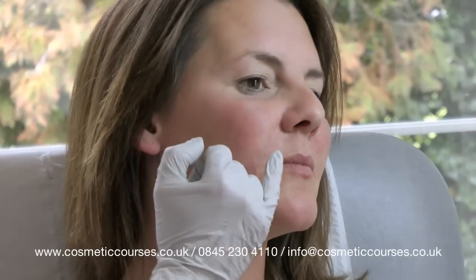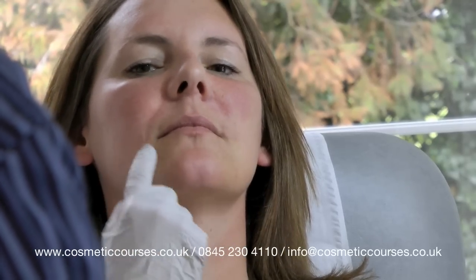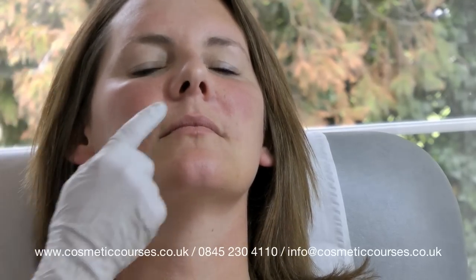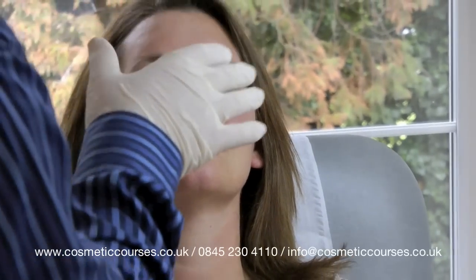Another day we could do this area here. Look at the canvas — we can say it's not quite finished; we could do this area and perhaps that on another occasion. You've got quite high cheeks, as you know, so you will still have a shadow there if you look at it in the wrong light. If you look straight on now, the deep groove is gone.